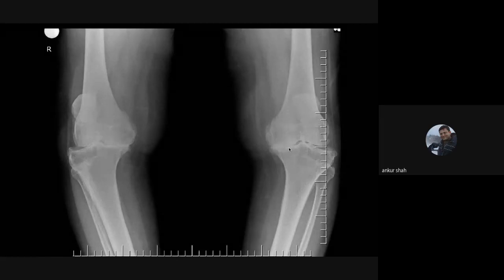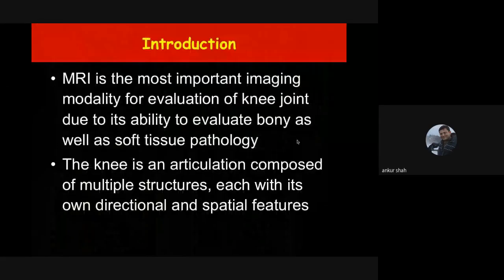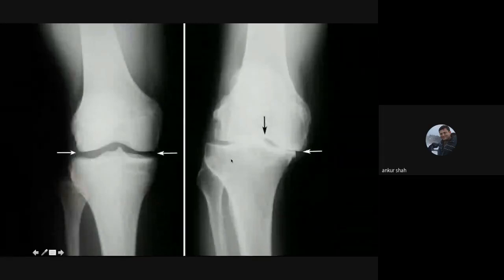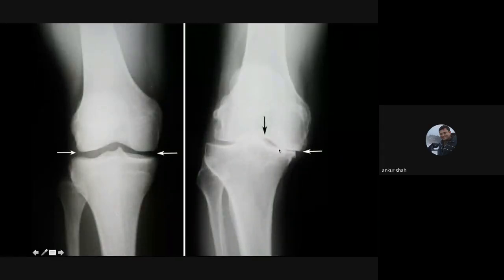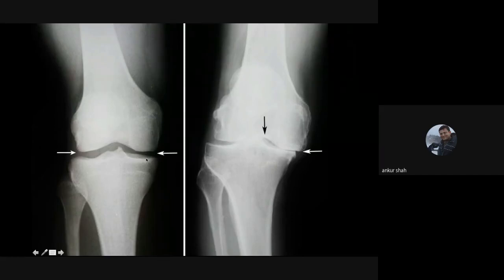Comparing with the normal knee joint where the joint space is preserved, here there is loss of joint space and presence of osteophytes. Radiograph gives us indirect signs of injuries such as degenerative changes because of loss of articular cartilage, but it does not give details of soft tissue injury.